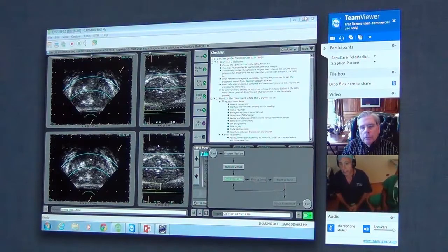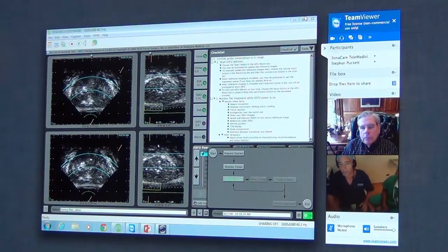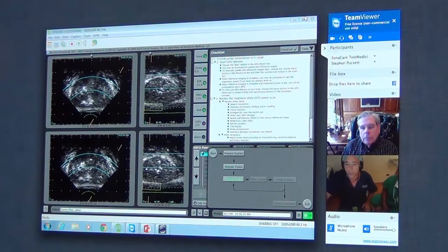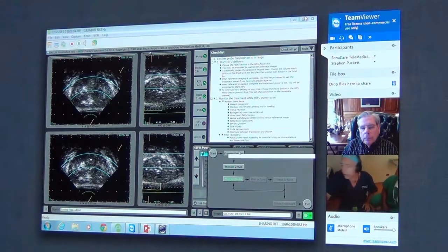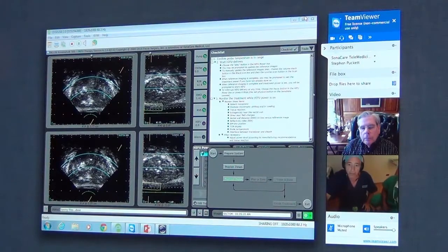And now we're going to position the probe so that we can treat the middle zone of the prostate. John, do you want to step up for me? Yes.